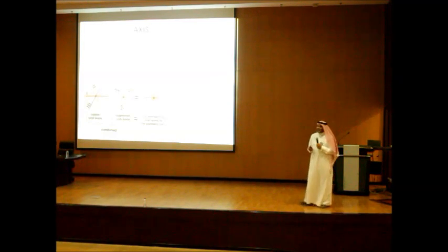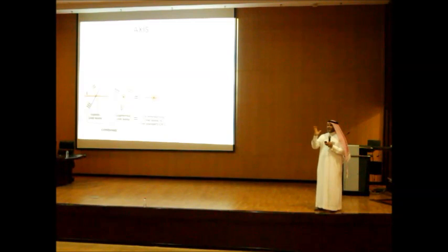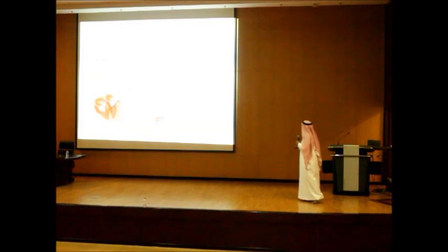Okay, then we'll talk about the axis of the heart. What is the axis of the heart? What do you understand by axis deviation? The axis of the heart refers to the way the impulse travels. Normally the sinus node is here, so when you have an impulse traveling, it will go this way, right? If you have chamber enlargement, right heart enlargement, the impulse will travel this way. Why? Because you have a big chunk of muscle. If you have ventricular hypertrophy, the impulse will travel this way because you have a big chunk of muscle on the right side. This is very easy.